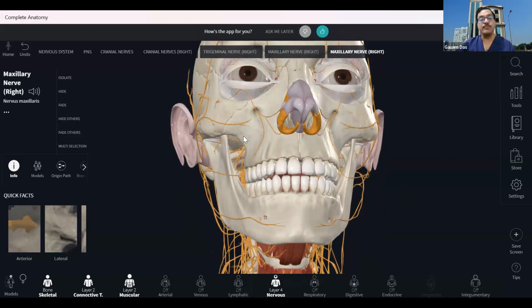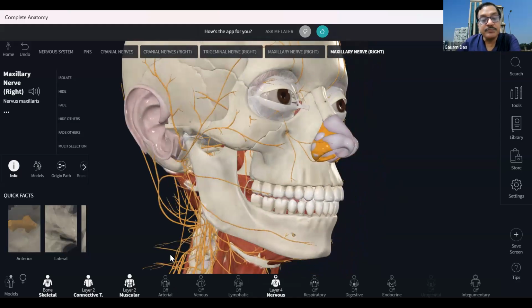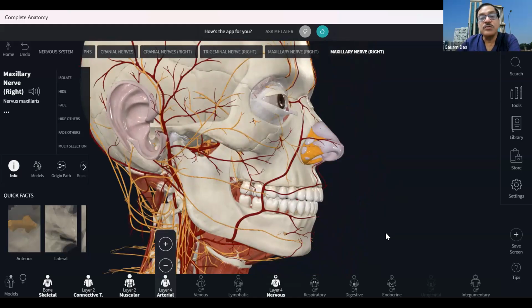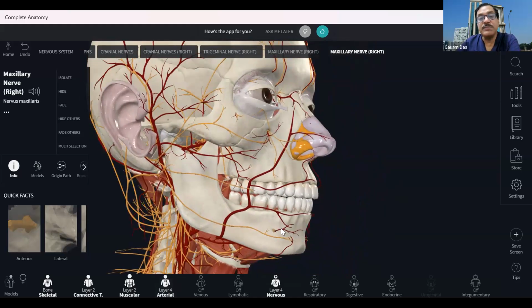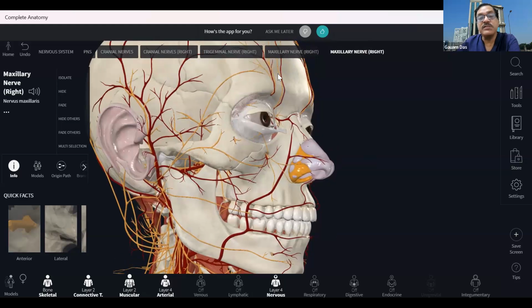Okay, another I forgot, let me put the blood vessels as well. Artery. Okay, so in the mental, there are tiny blood vessels, you see. Here also tiny blood vessels, here also tiny blood vessels accompany the nerve. So mostly we identify the blood vessels to identify the nerve.